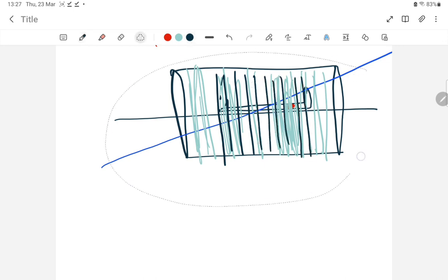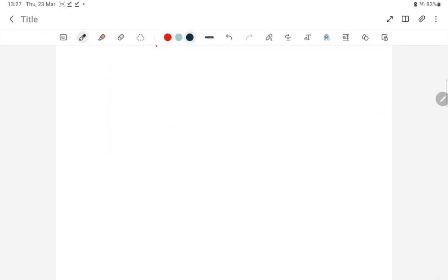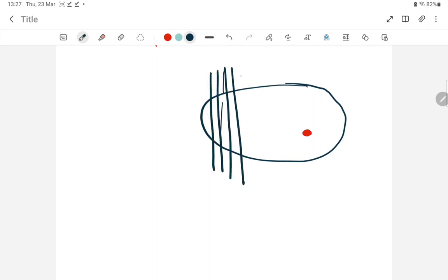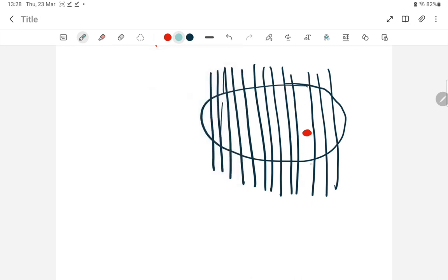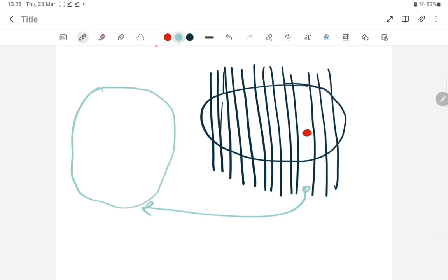Imagine we have one potato, and there is a tumor here, and we applied a magnetic field, a gradient. Now we are cutting this potato into small slices, like we are applying a gradient, one chip. So here you can see your tumor. From here, one chip you took out, and if you see that chip, your tumor is here. Now again one challenge. What is the challenge? Now you forget about your potato.